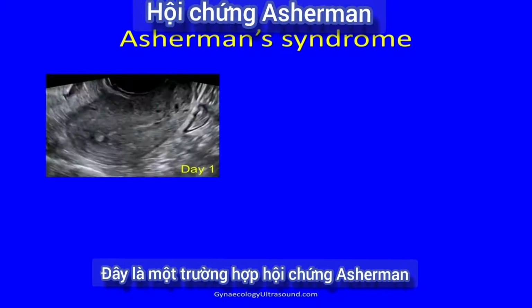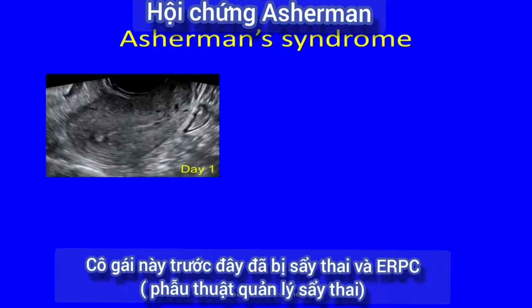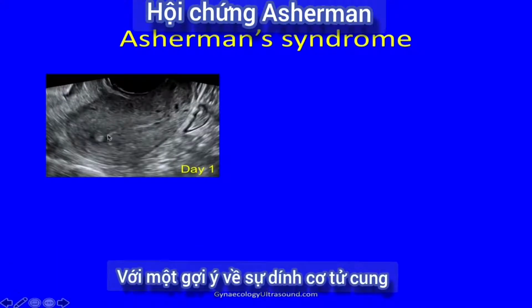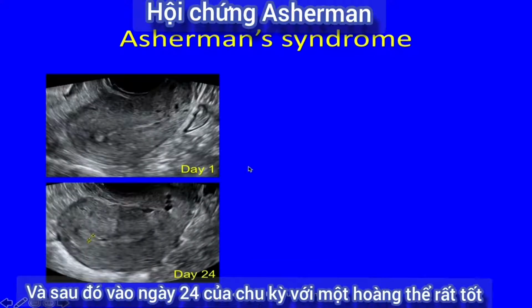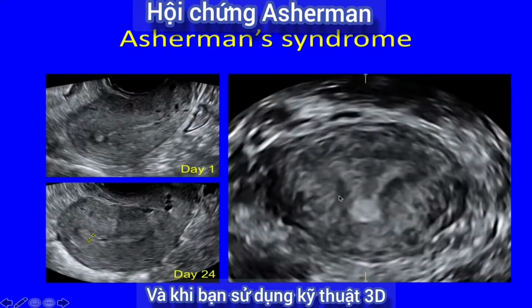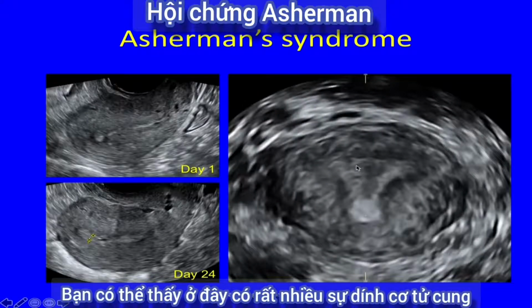This is a case of Asherman syndrome. This lady had had a previous miscarriage and ERPC. And here you can see a very thin endometrium on day 1 with a suggestion of some myometrial adhesions. And later in her cycle on day 24, with a good corpus luteum, the endometrium stayed very thin. And when you put 3D on, you can see here, this is the endometrial cavity. You can see here there are lots of myometrial adhesions.